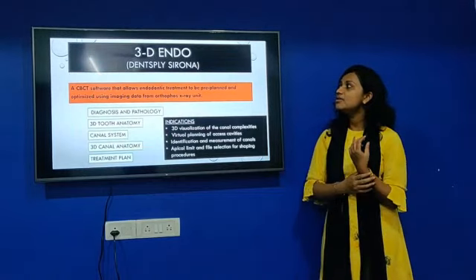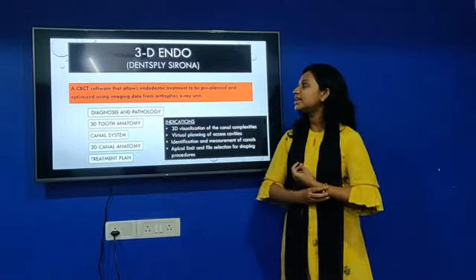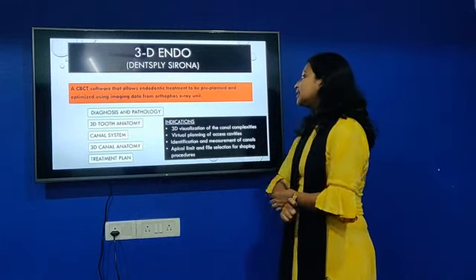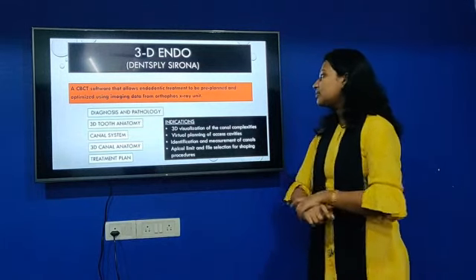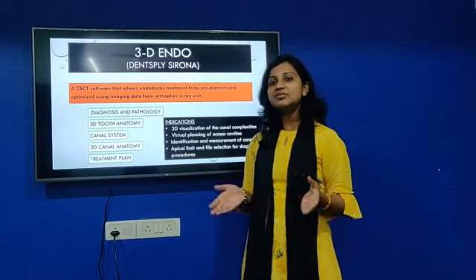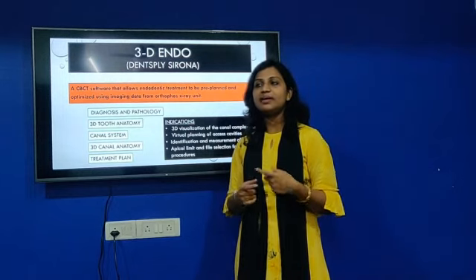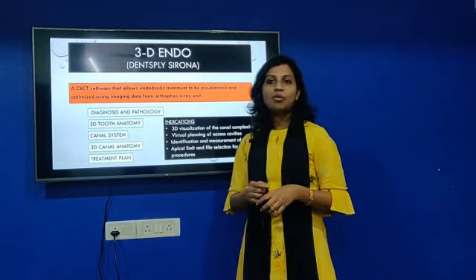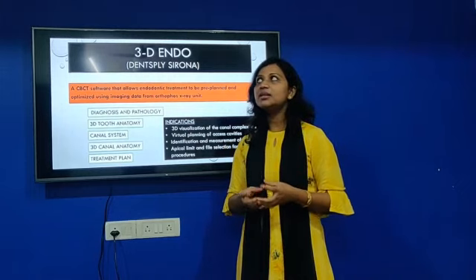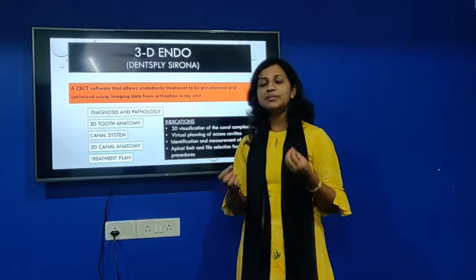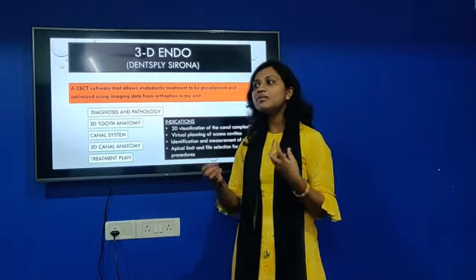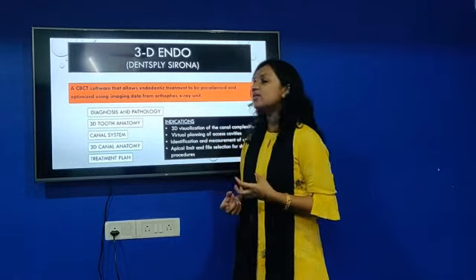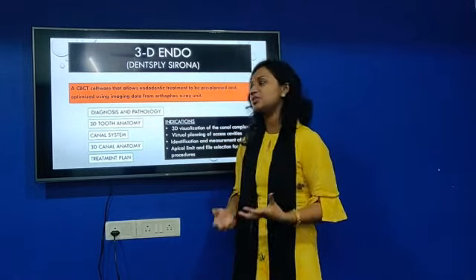The next treatment: I want you to know about a software called Dentsply Sirona. This is a CBCT software, but even before starting the treatment you can plan the treatment — visualizing the canal, doing treatment planning and diagnosis, and knowing what instrument size to use. The software gives you suggestions.